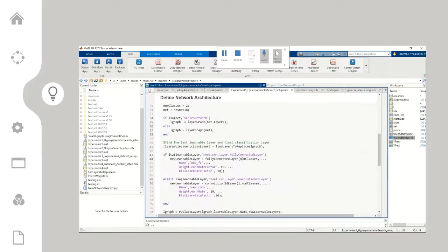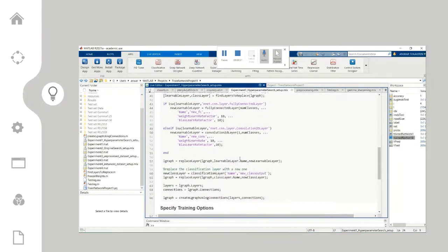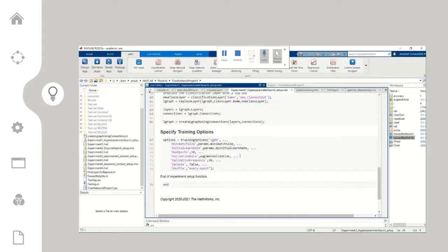The code here shows how the transfer learning process works. The last trainable layer, which is the fully connected layer in ResNet18, and the classification layer will be replaced with new ones. And then for the training options, I'm using the stochastic gradient descent optimizer to learn the features from the images. Since I will train all of the models with different hyperparameters, the mini batch size and the initial learn rate will be set up in the experiment manager.